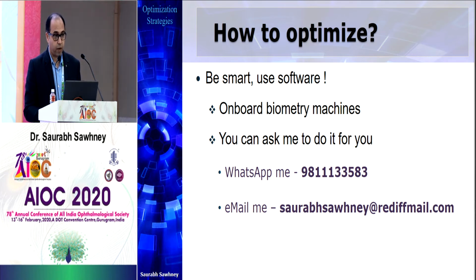Now when I say optimize the constants, you have to optimize also for the individual formula. So SRK/T, you have to optimize the A constant. If you're using Holladay, you have to optimize the surgeon's factor. If you're using Hoffer Q, for example, you have to optimize the PACD.